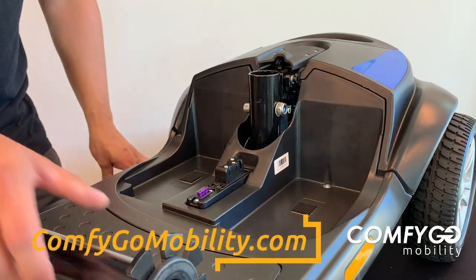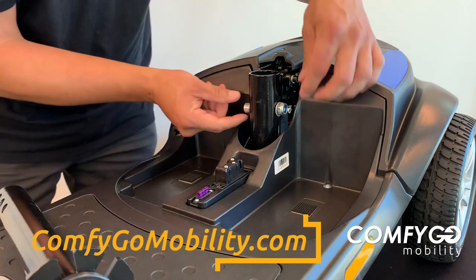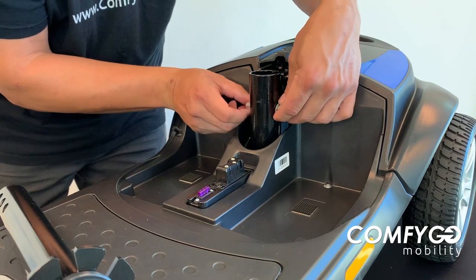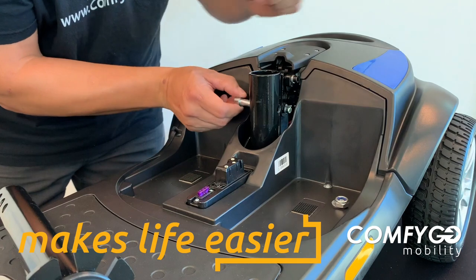The first part of the assembly is going to be putting your seat post into the seat post shaft here. Now the bolt's already assembled here, and you have your nut here on the left side. I'm looking at overhead, so take this out exactly how it is right now. Make sure you hold on to this washer and this nut right there and pull this out.